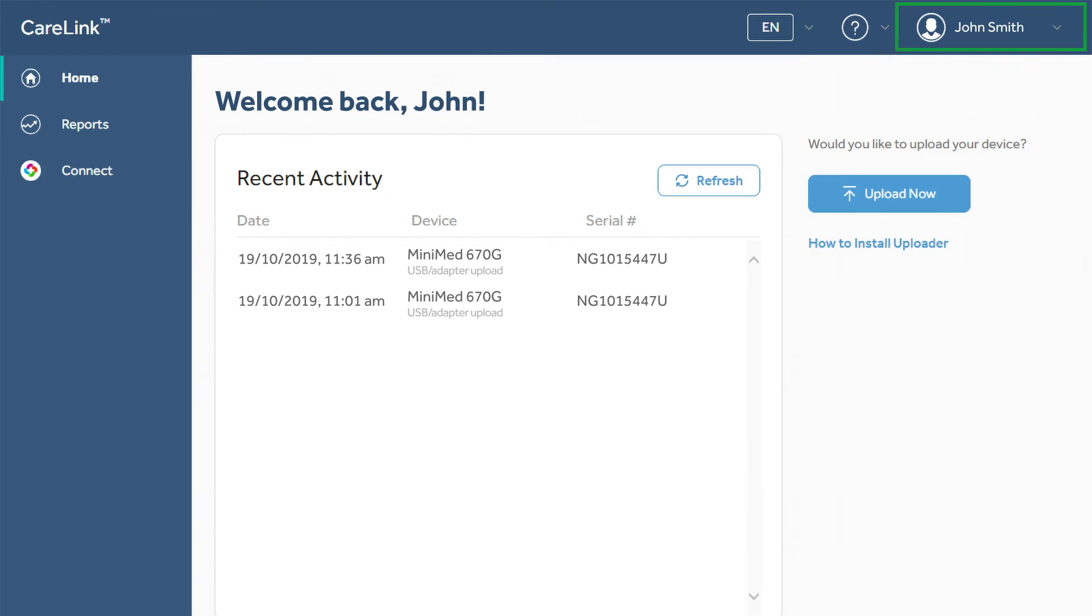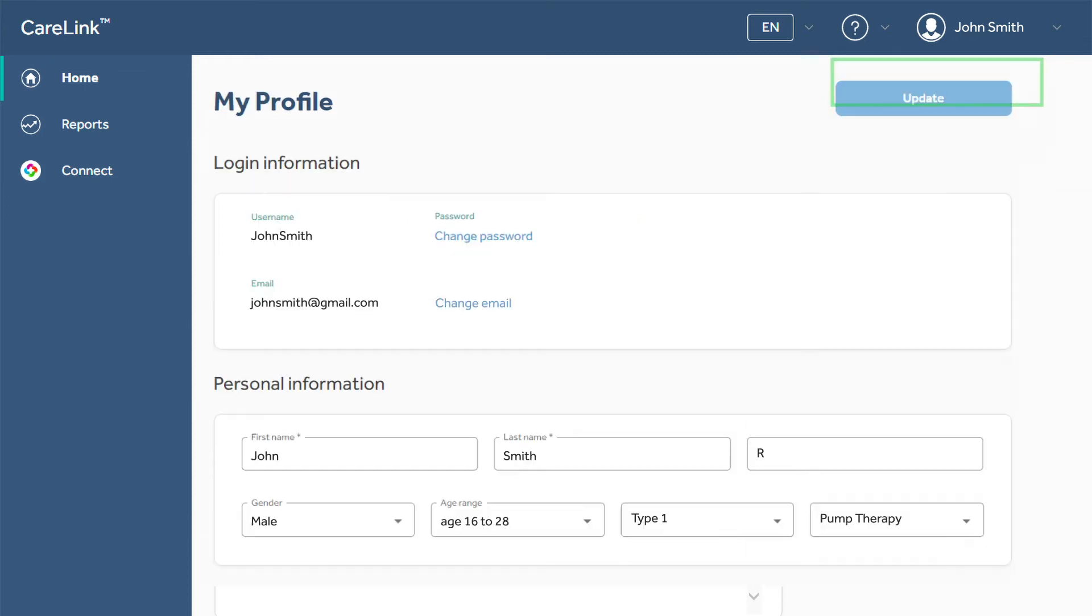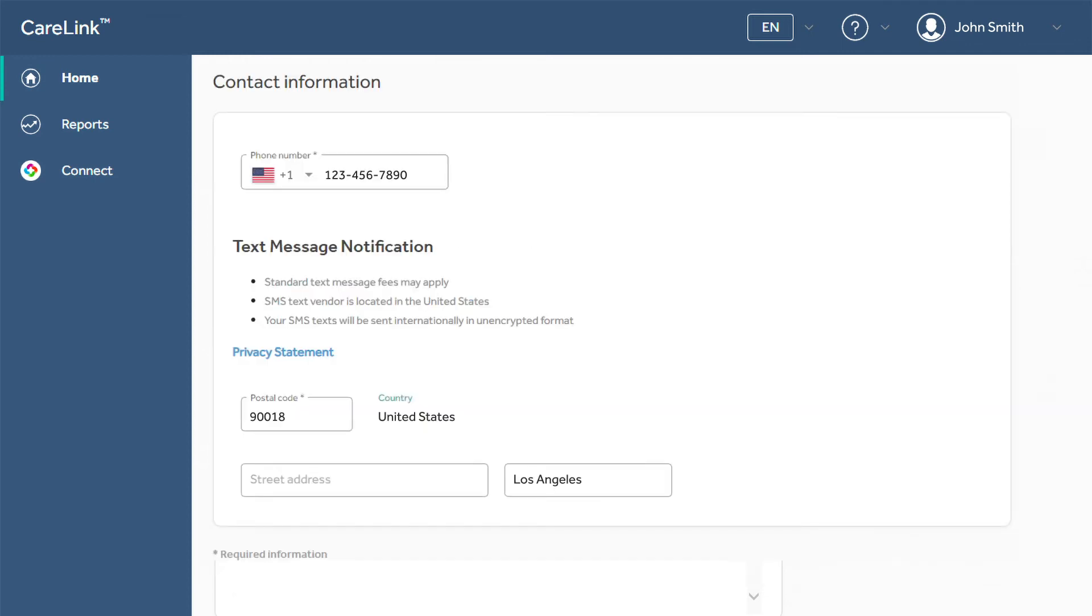Quickly access your account information by selecting your name to see a drop-down menu. My profile lets you access all of the personal information that you entered when creating your account. You can change your password or email address, as well as edit your address and contact information.